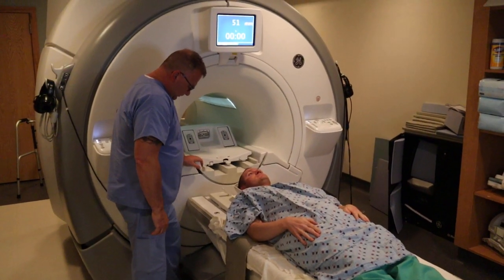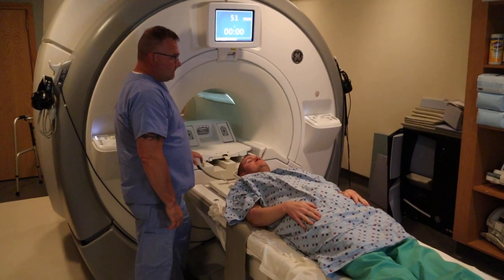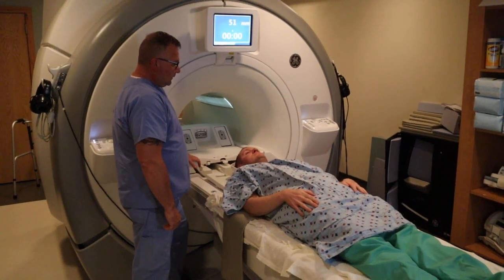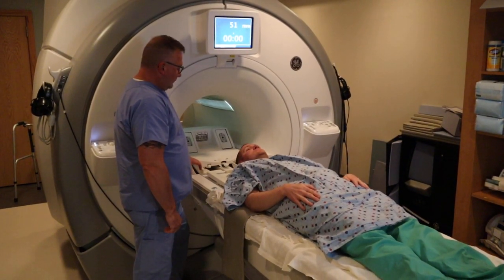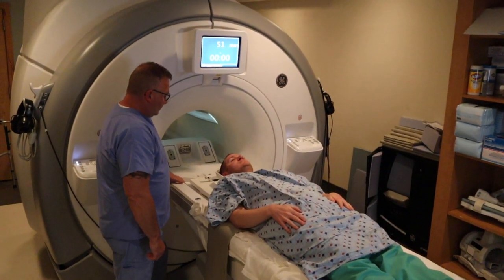Today we're going to be discussing how to position for an MRI brain. In this patient setup you can also scan for an IAC study, a pituitary study, cranial nerve, or an MRA head.